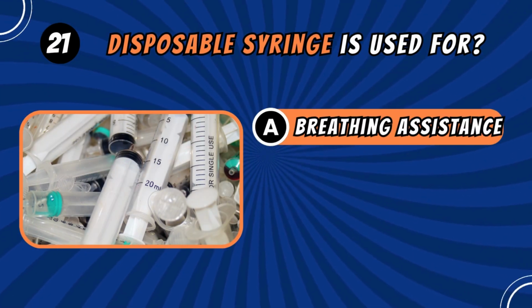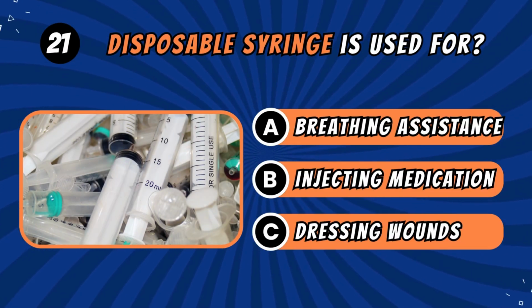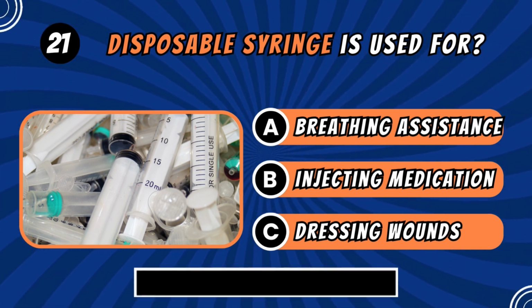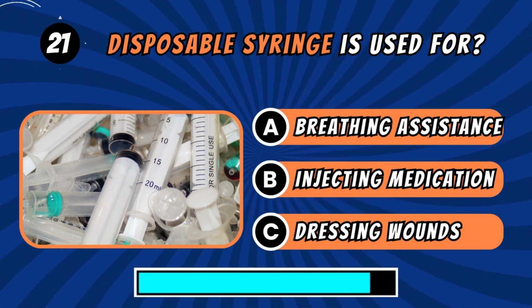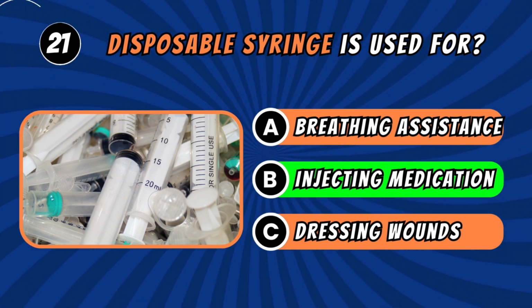Disposable syringe is used for? Answer B. Injecting medication.